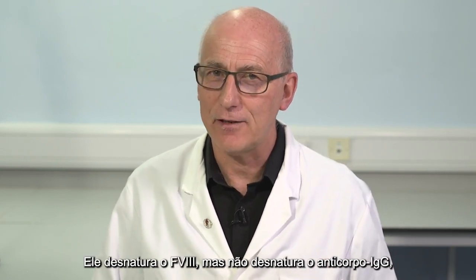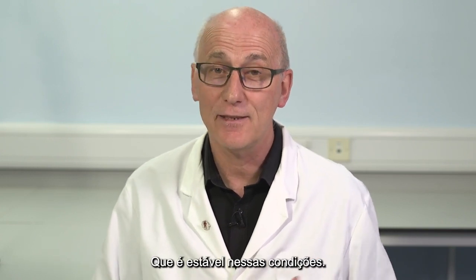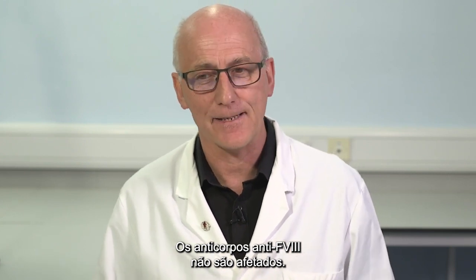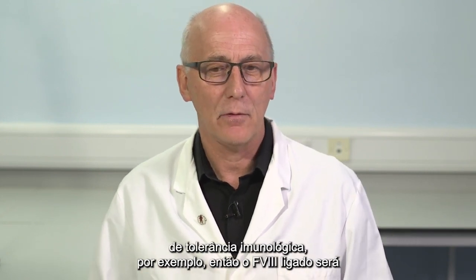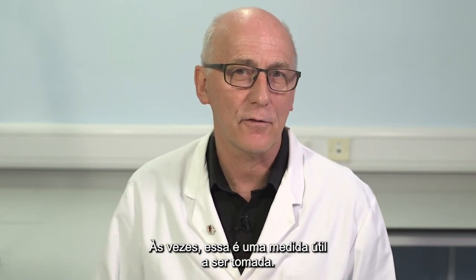It denatures the factor VIII but does not denature IgG antibody. This is stable under those conditions, so the anti-factor VIII antibody is unaffected. If that antibody were bound to any factor VIII, perhaps during immune tolerance induction, for example, then the factor VIII bound will be removed, will be degraded, and that antibody will be released. Sometimes that's a useful measure to do.